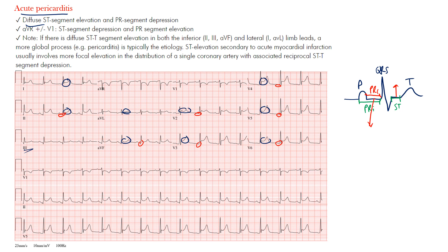You'll also see what we consider reciprocal changes in lead AVR and sometimes in lead V1. Instead of seeing the PR segment depressed, you'll see PR segment elevation and ST segment depression. Looking at AVR here, notice the PR segment is up and the ST segment is down. In V1 you can see the ST segment depression, maybe not so much the PR elevation.